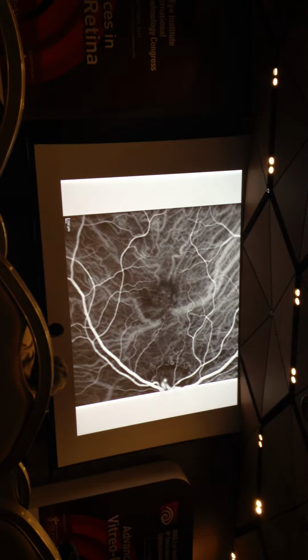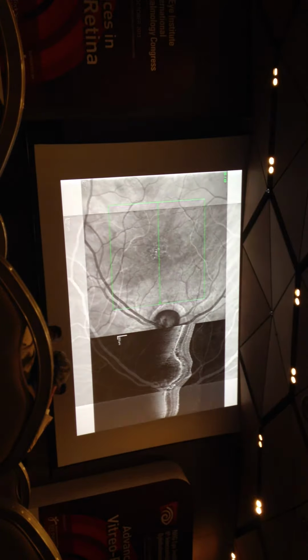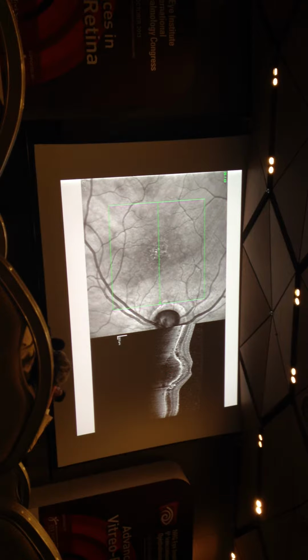Another trick for detecting the lesion on ICG is that you see this huge choroidal vessel, and you actually see that it's masking, so that is actually the lesion. All the masking tissue is closer to you, and if you take a stereo, you will see very well that it's covering the normal choroidal vessels. So, an occult lesion, and if you look at the OCT, you can actually see a very nice lesion.